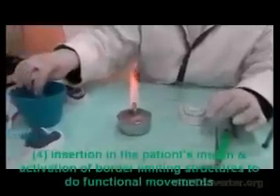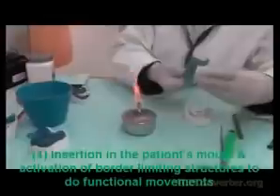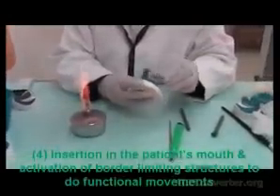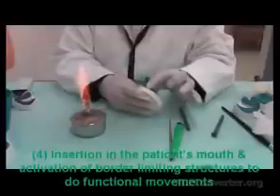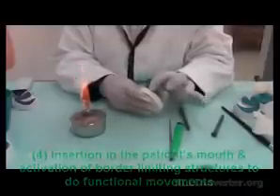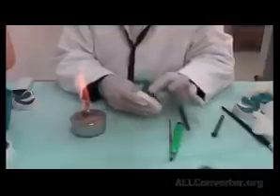I go to the warm water just to cool it down, because it's much hotter than the material. The flame made the material very hot, so I put it in warm water to cool down a bit, but it's still pliable, and I press it inside the patient's mouth.